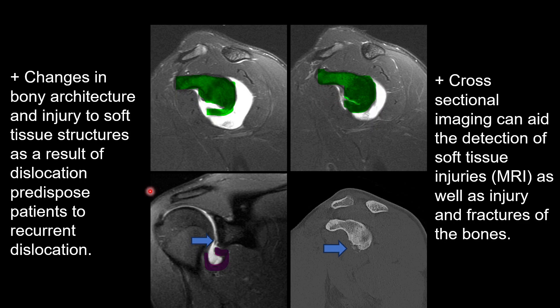T2 MRI will also give us a good look at the soft tissue structures surrounding the shoulder joint. So we have again the humeral head, the glenoid, as well as in purple the capsule, and a blue arrow pointing to the labrum, which in this case we can see is torn from the glenoid. We can also see a defect in the anterior inferior portion of the glenoid here. Finally, the CT image allows us to clearly see that same defect in the glenoid.